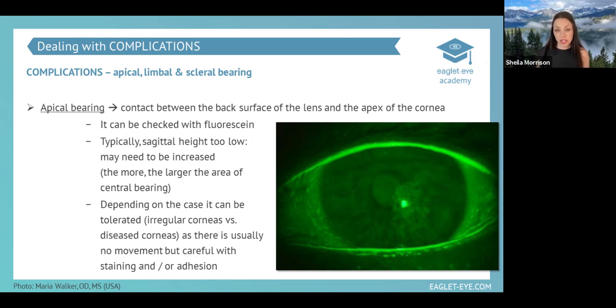I'm very, very safety conscious. I know, rule number one, when it comes to contact lenses on any patient: safety first. Whenever we create a spot of bearing, we create a wound in a lot of cases, and that opens the cornea up to microbial keratitis or other infections that can then pass through that cornea, especially in eyes that are just a little bit more compromised.